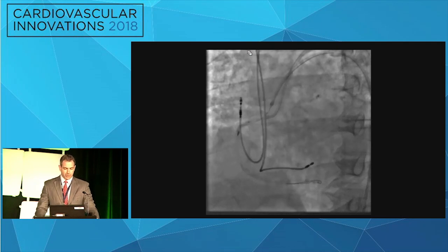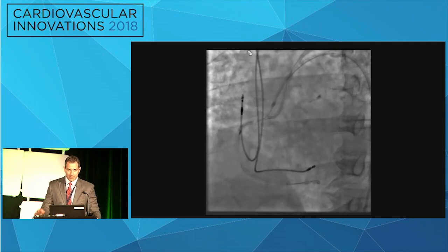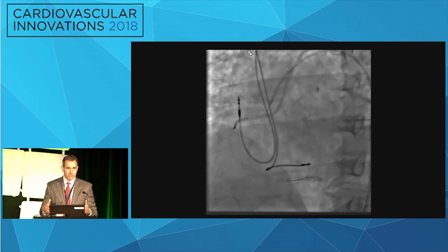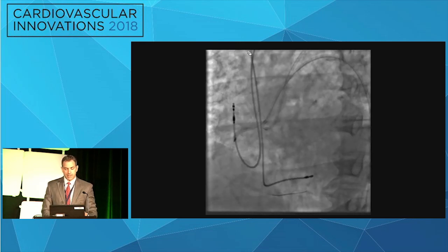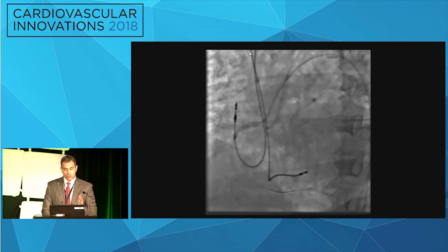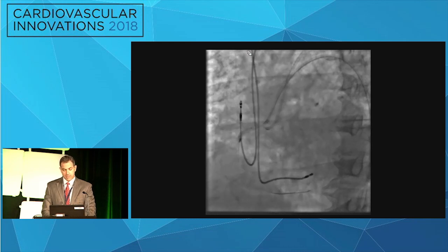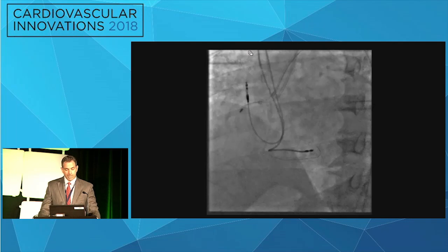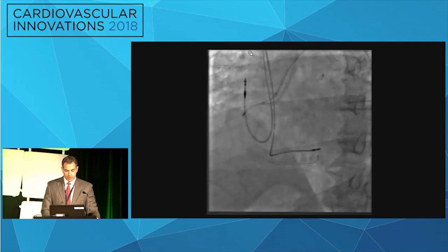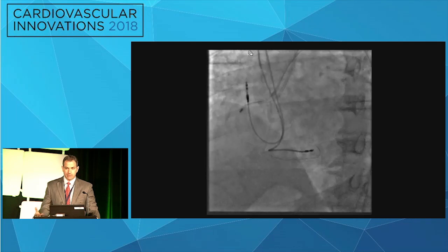Again, if you look at the balloon distal marker, you can see it's not really past the Rotablator burr. We just got it right into that proximal edge as far as we could get it, but we were hoping we could change the conformation of the calcium enough to be able to retract. Again, after the 1.2, this was actually a 2.0, no success. We went to a 3.0. Again, tried ballooning, and after that, we tried to pull back or forward, and were unsuccessful.